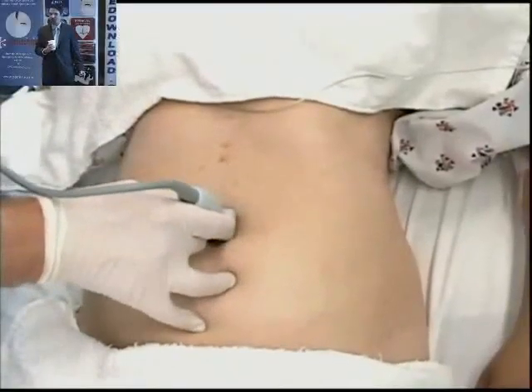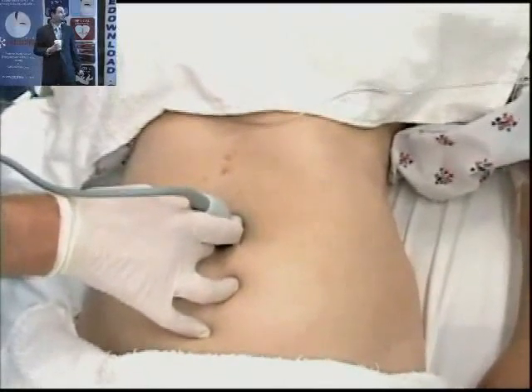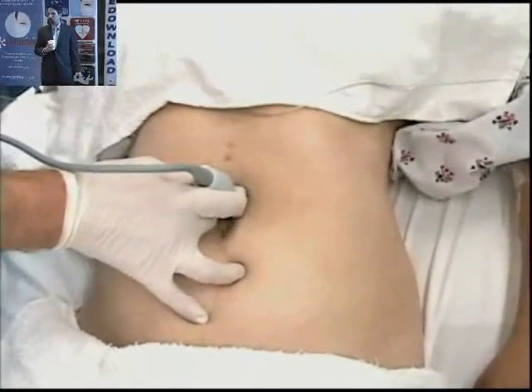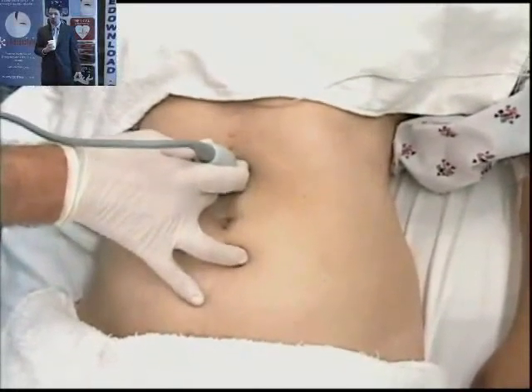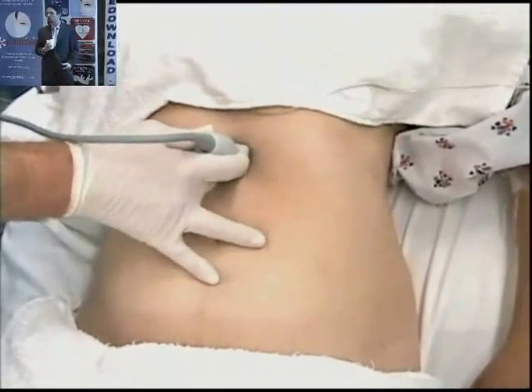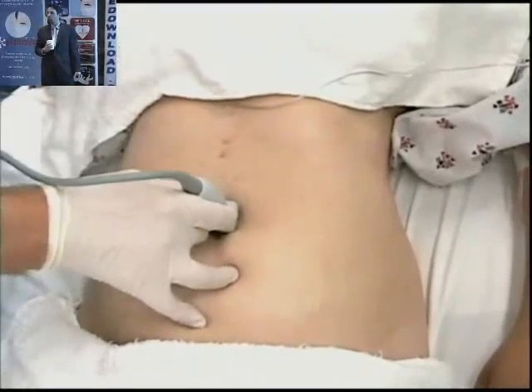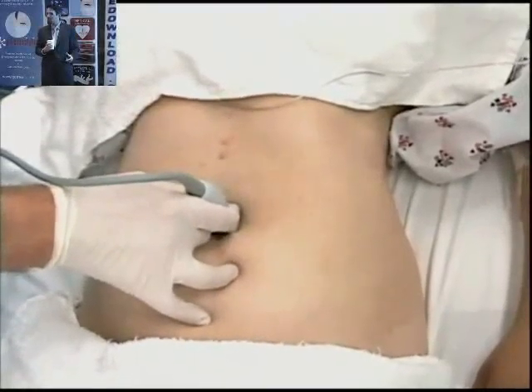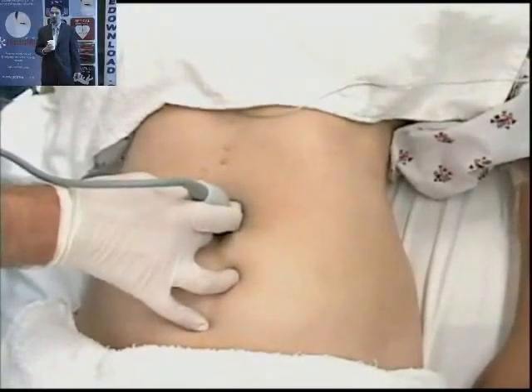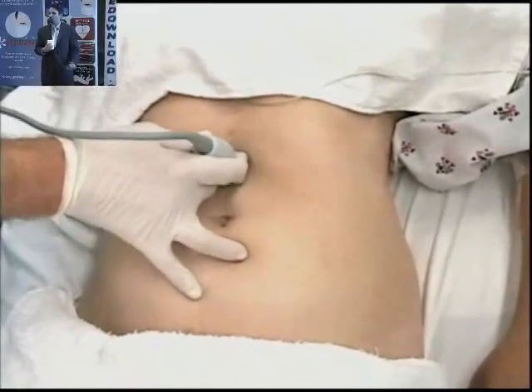And this is how you do it. So this video shows we're scanning in the transverse. We're cutting left to right. The probe marker, according to the golden rule, is pointed towards the patient's right side. And you can either start in the epigastrium or start, as I like to do, right above the umbilicus. The umbilicus is located at about L4, which is the level of the bifurcation of the aorta. So starting there, you're going to pick up the vast majority of your AAAs.